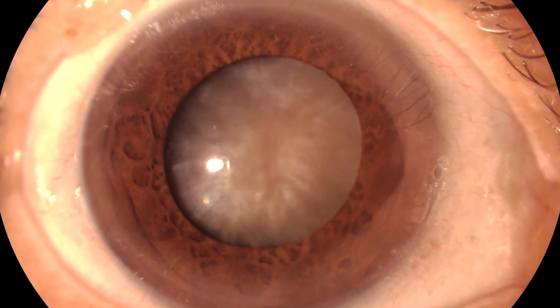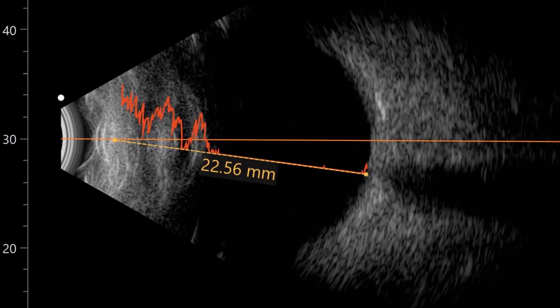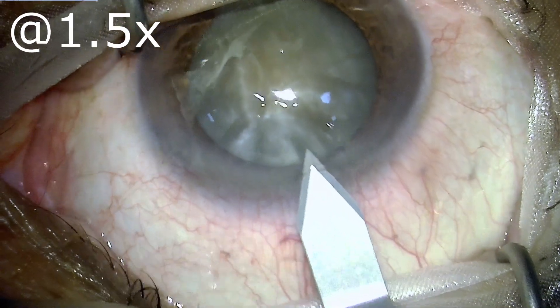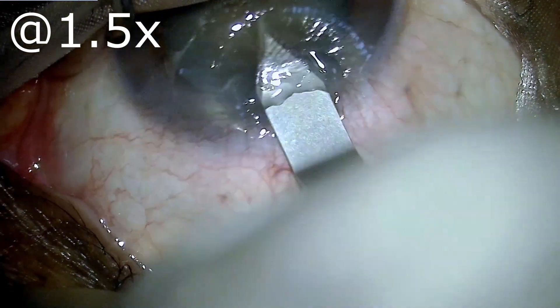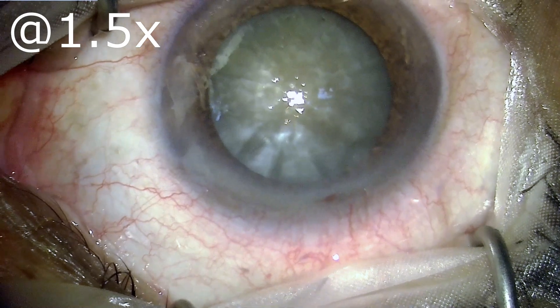This is the B-scan of a patient because the fundus was not visible due to the dense cataract, and the patient was planned for this surgery. The surgery has been fast-forwarded at 1.5 times the normal speed so as to keep the viewers engaged.